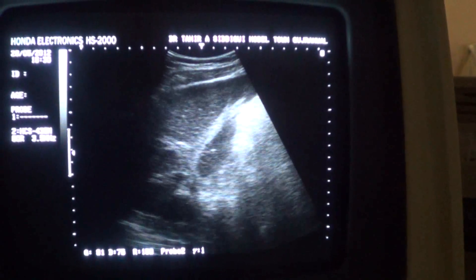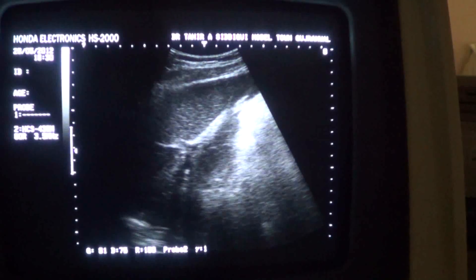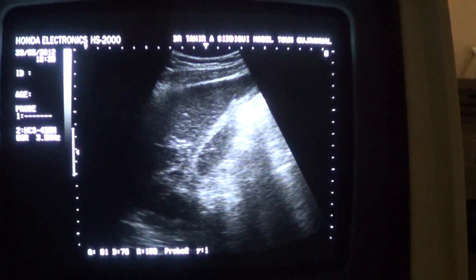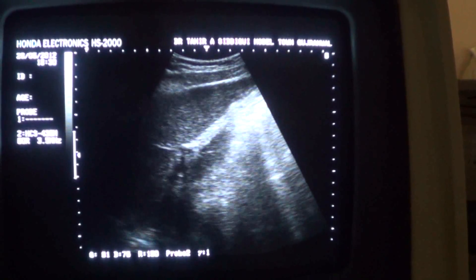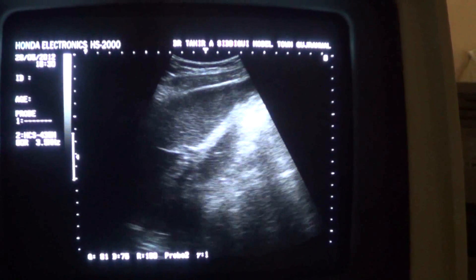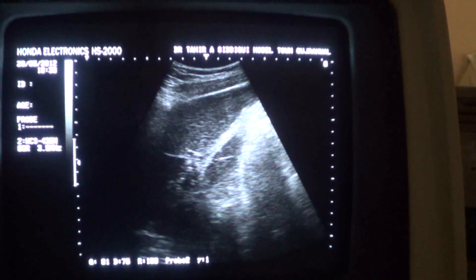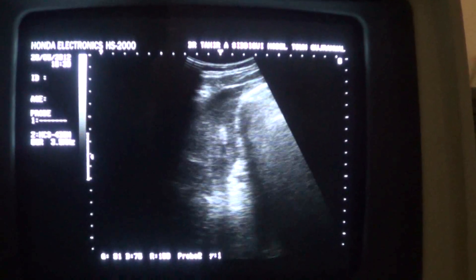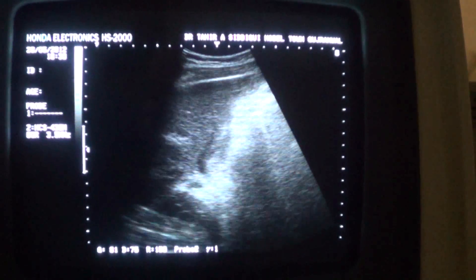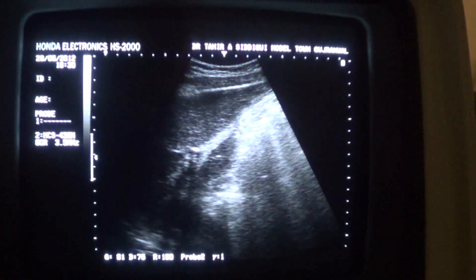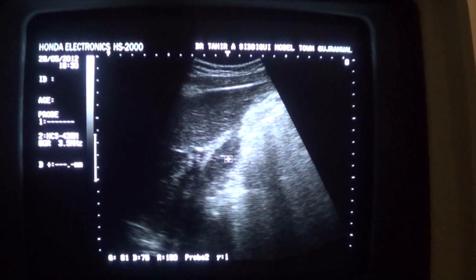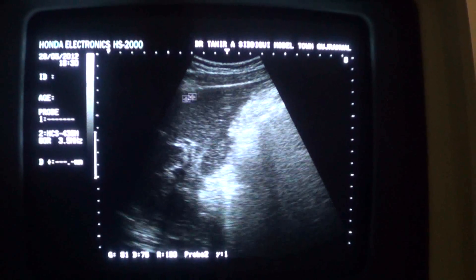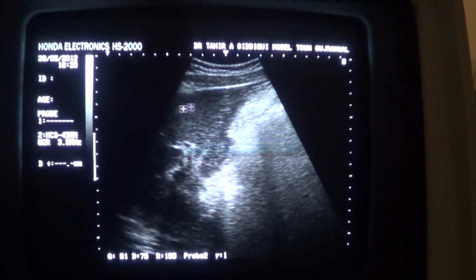This emergency case study involves a patient who has fallen from the roof from quite a height, 12 days ago. This is an emergency ultrasound and I will have to do it as soon as possible.